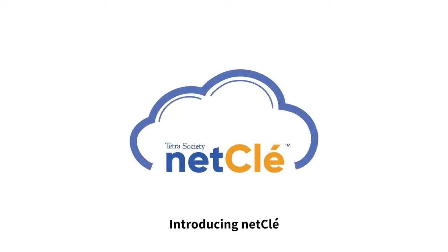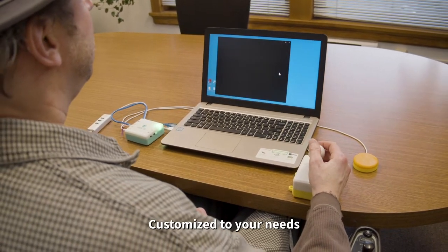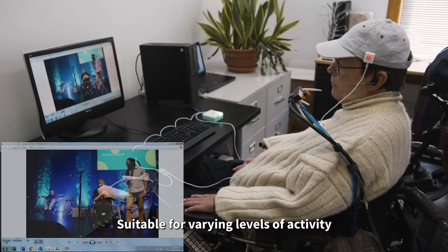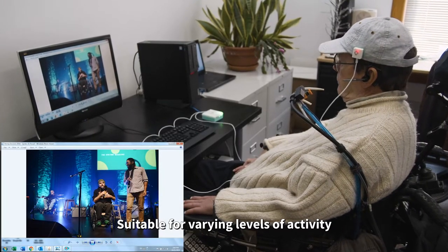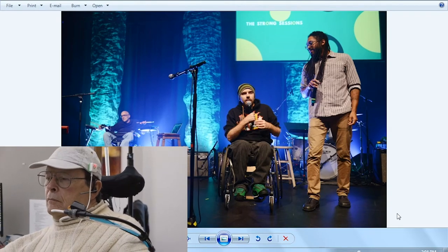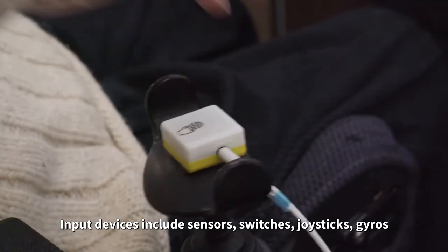netClé is a device that translates what you can do to what you want to do. netClé is the first access method device that is affordable and customizable. Users with varying degrees of mobility are able to tailor inputs to their exact needs, allowing them to interact with their computers by plugging in one or more sensors or switches that they are able to manipulate.